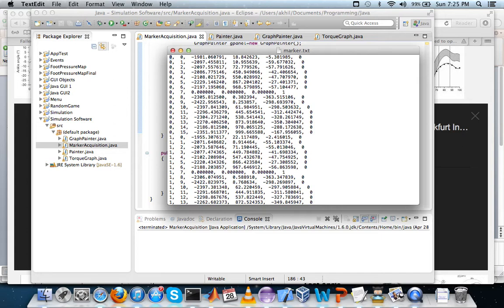You can see the first number is actually the frame, the next number is the LED number, and the next three numbers are the X, Y, and Z coordinates of that particular LED. The first six LEDs correspond to positions on the right leg. LEDs number 8 to 14 correspond to positions on the left leg, and the 15th one is at the back, the 7th one is not being used.